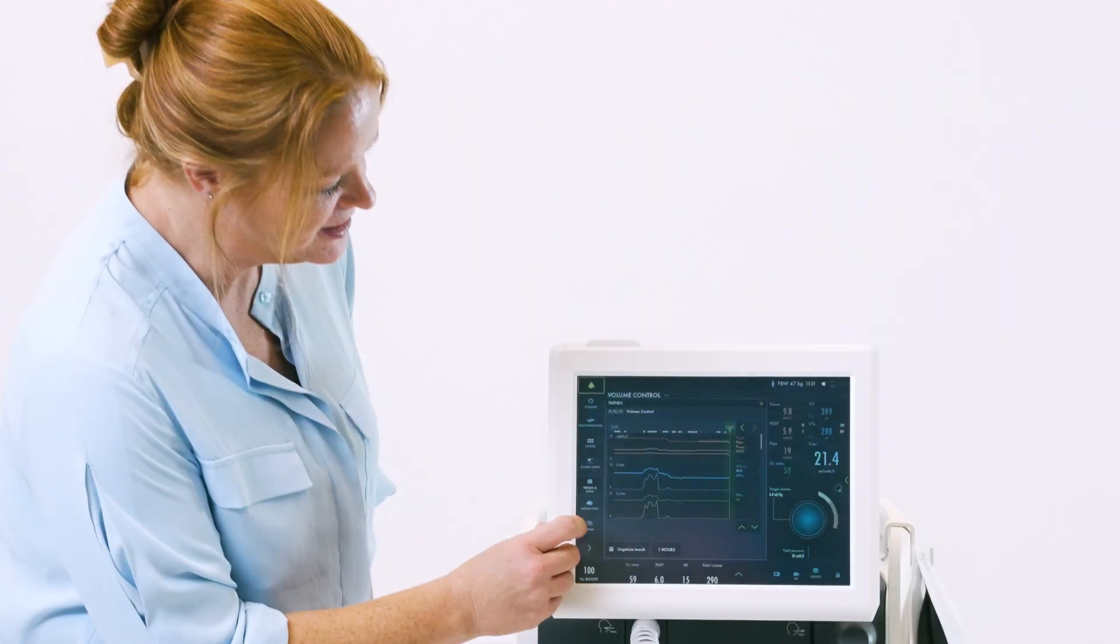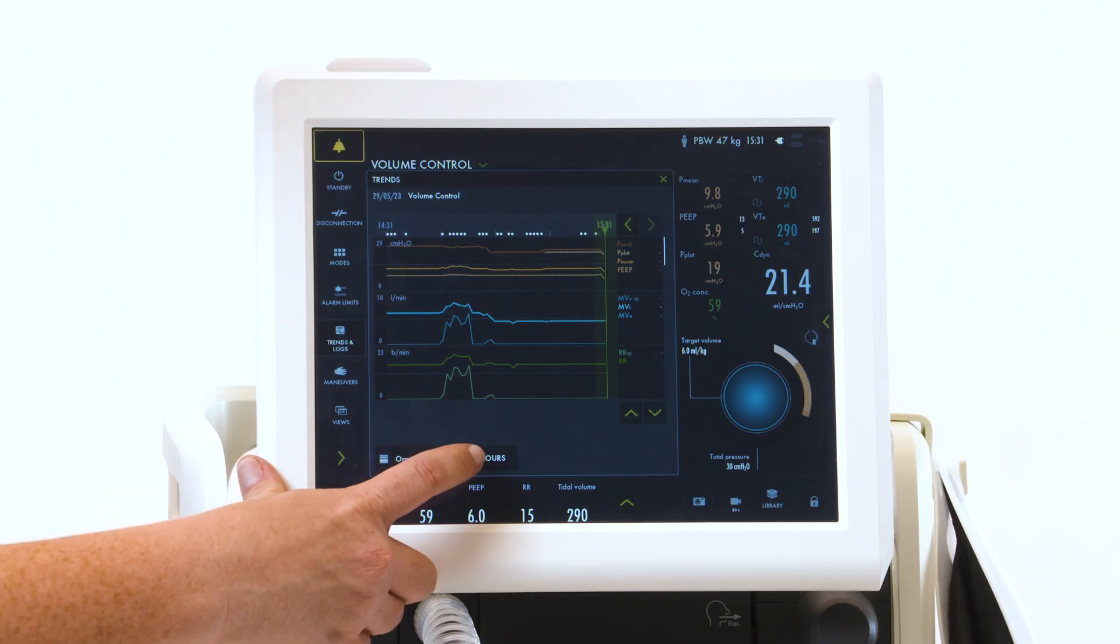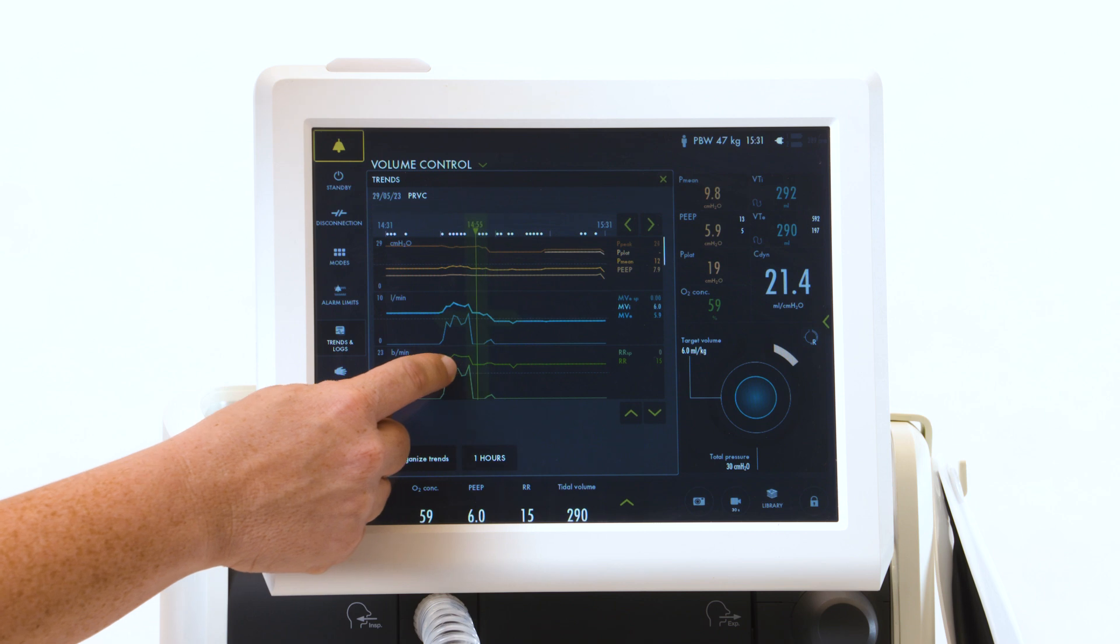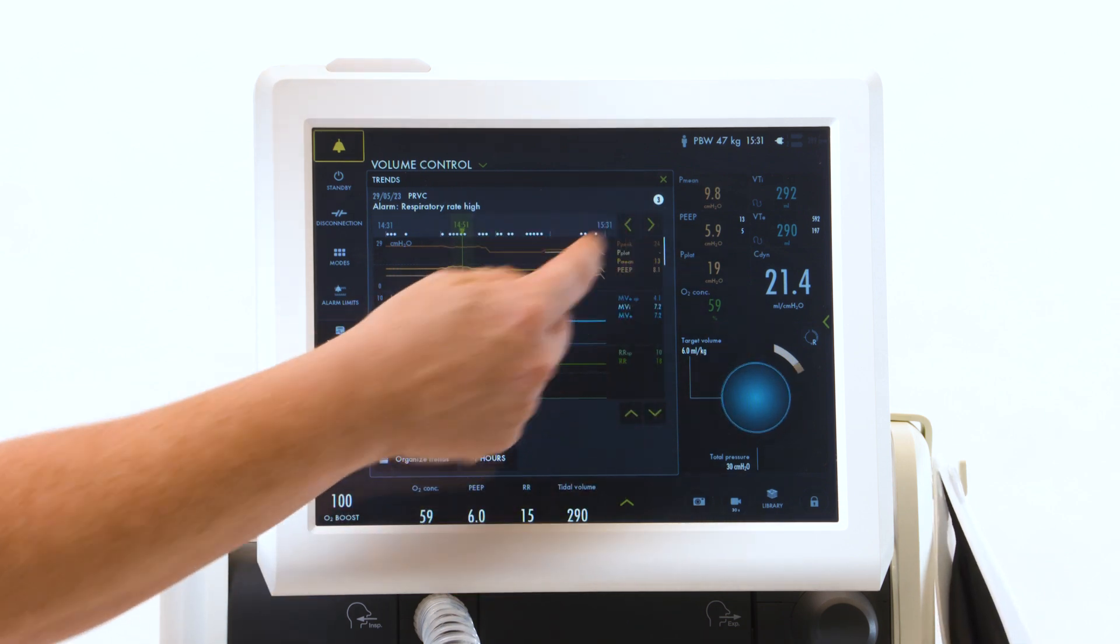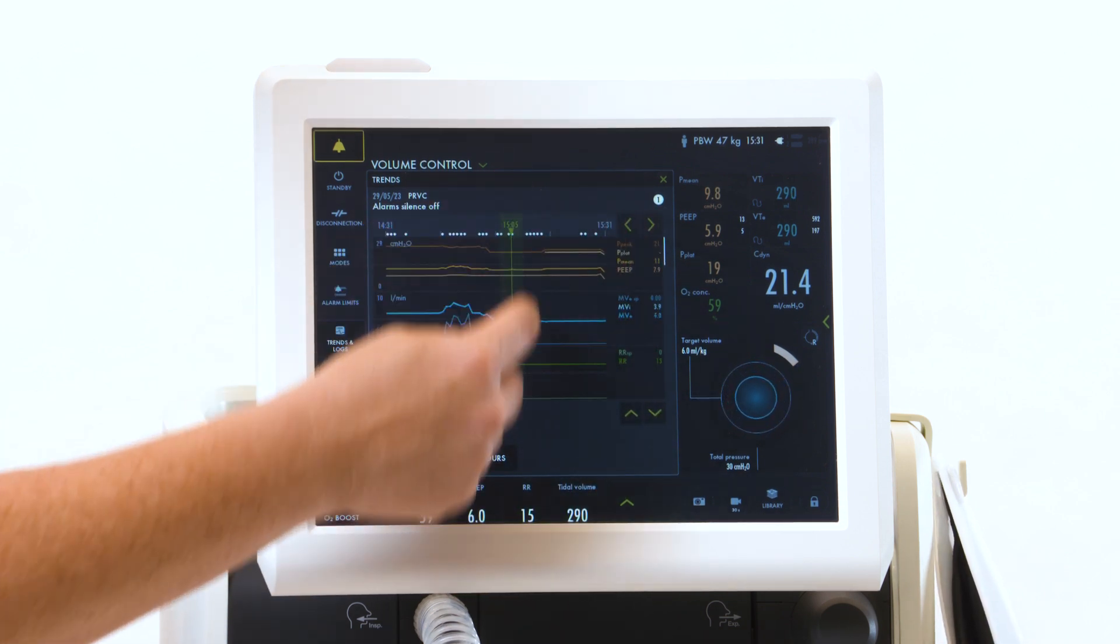When looking at your trends, you can look anywhere from an hour up to 72 hours of time. As you move your cursor, your numbers that appear will be the numbers along that axis.